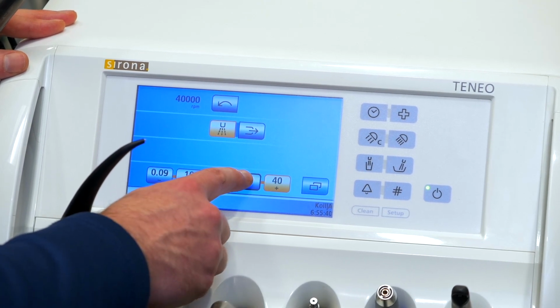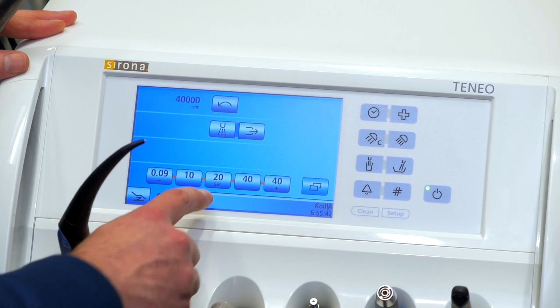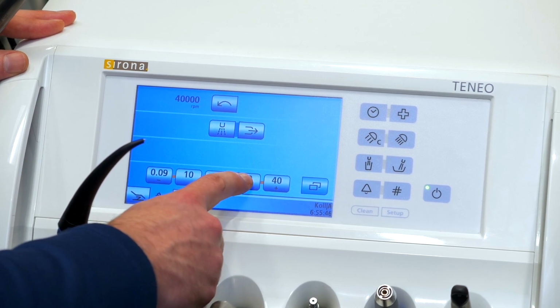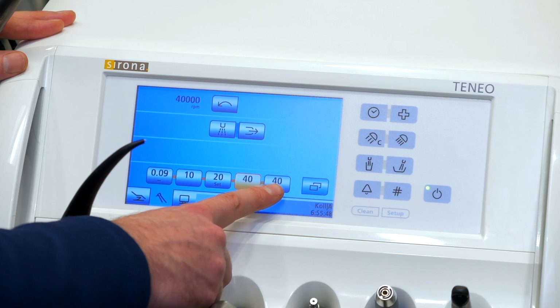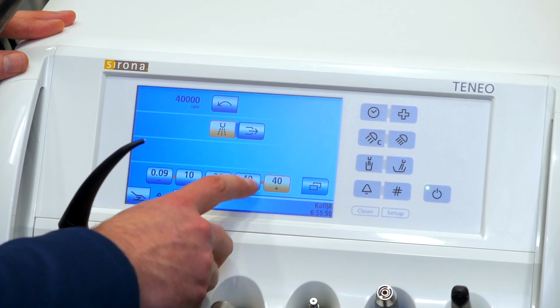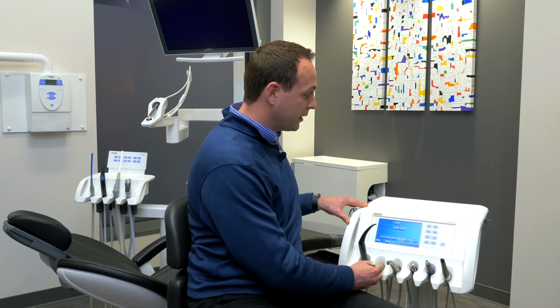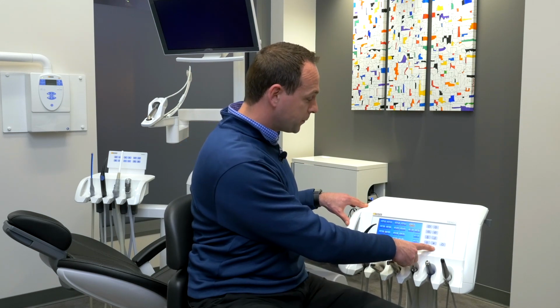So I can change that by turning water off, holding set, and saving that into a different position. Now I have one 40,000 with and one without water. And those are the three different types of ways you can interact with the handpiece customizability.